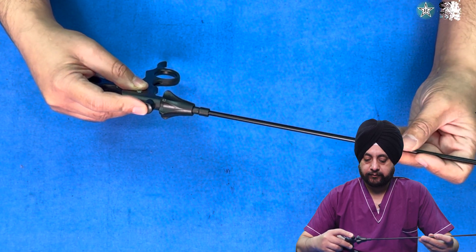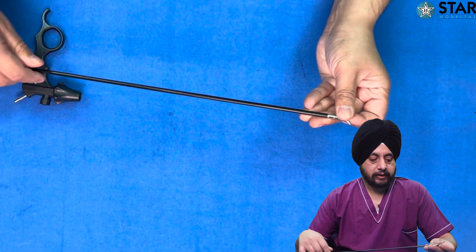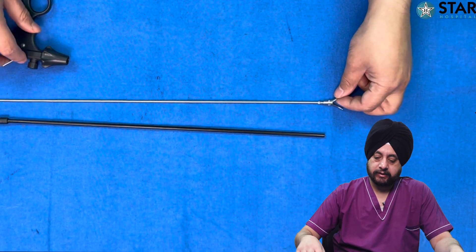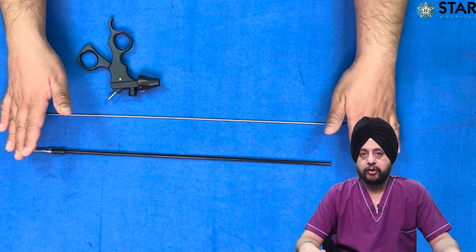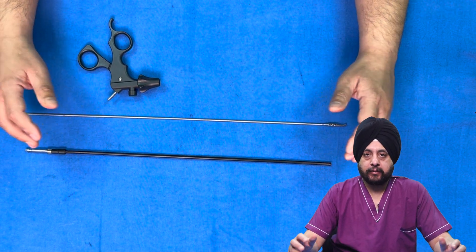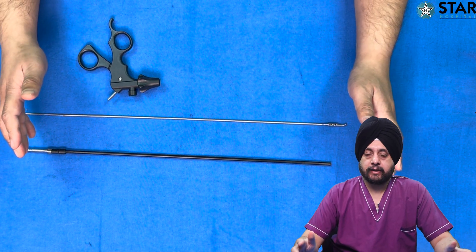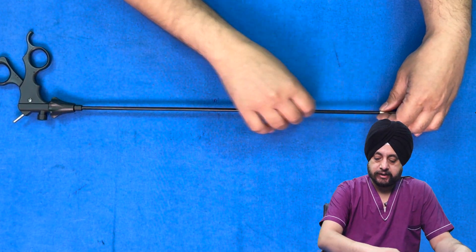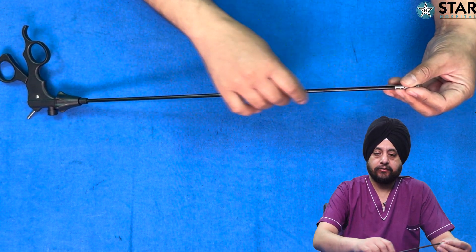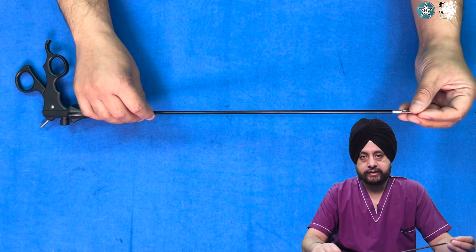This is the release button — press it to disengage so you can clean it. For cleaning you must disengage and open the insert by rotating it so it comes out. Once properly disassembled, clean it fully before reassembly, because otherwise you are not able to clean the inner parts — debris will lie inside, it won't get sterilized well, and will slowly degrade the instrument. Always check the insulation sheath after all uses and even before using the instrument, so that you do not cause any injury. If there is a break in the insulation, you can change just that particular part and reuse the insert as well as the handle.